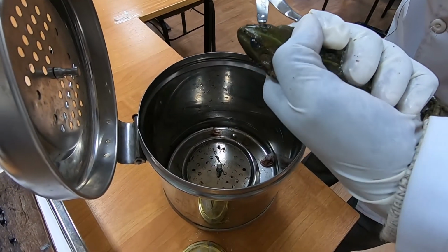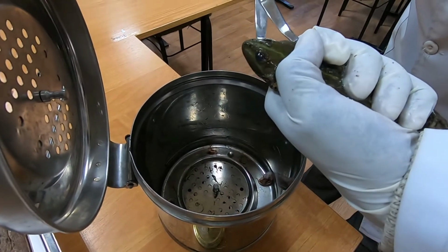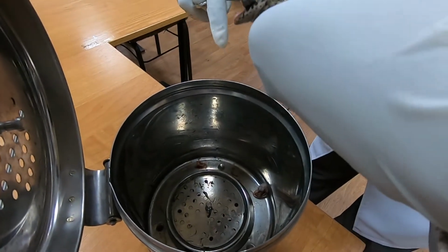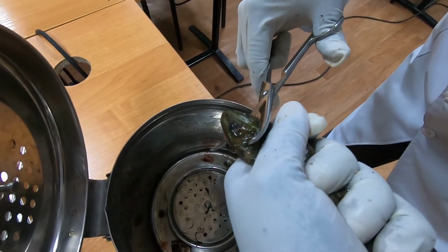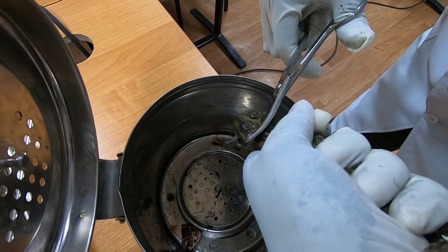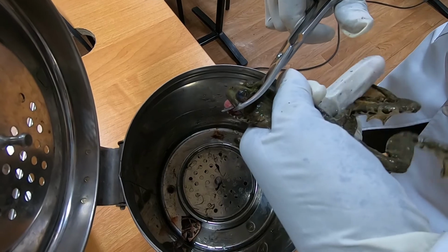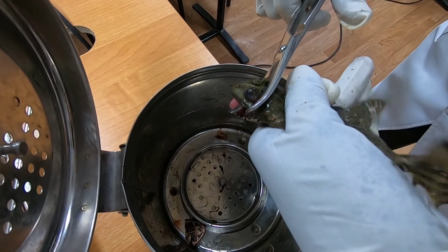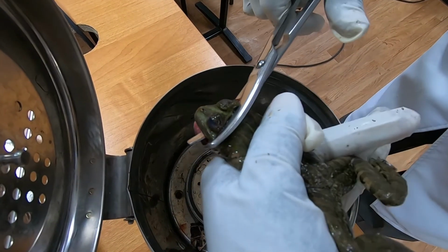So we open the mouth. Doesn't want to. Okay. And we take it to the end and fix it, and then cut off the head. You can see it shaking already, yeah? You can see it because we have touched the central nervous system. You can see it already.